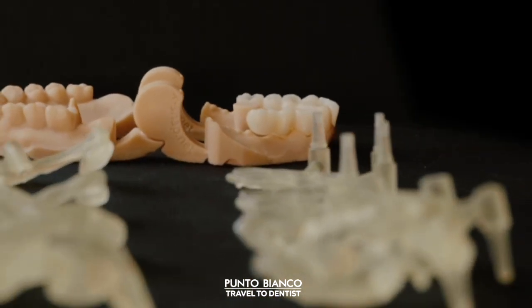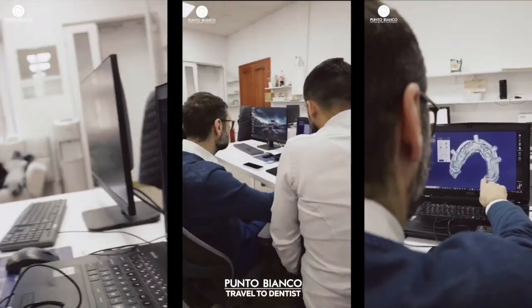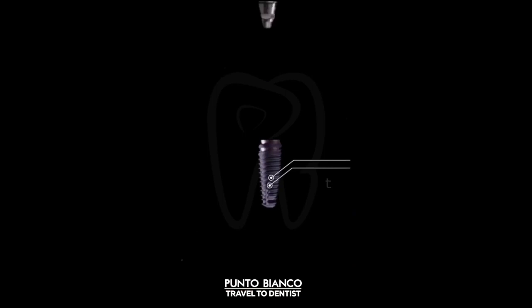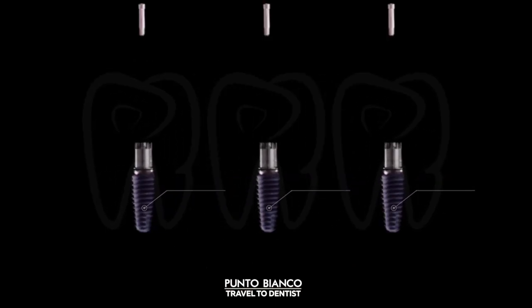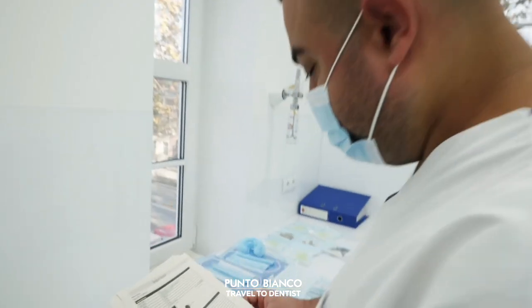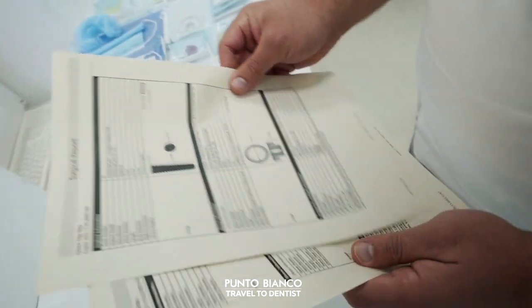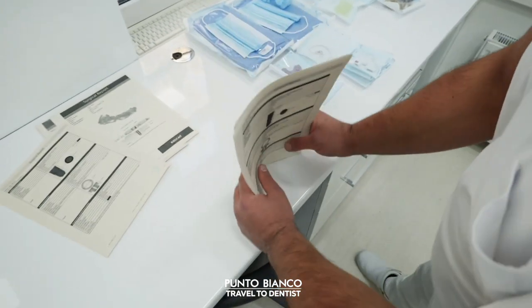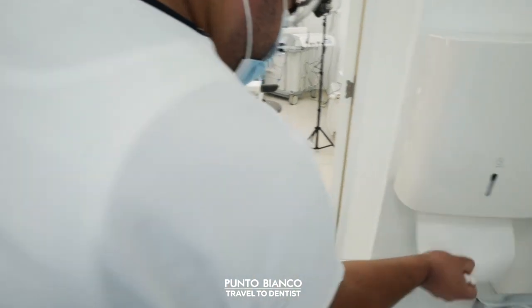You see, all of these components have been previously manufactured in order to have the capability to perform this procedure and more. We planned every implant down to the millimeter in accordance with the plan. It was carefully planned, and a report was generated to ensure that we accurately insert the implants in the correct location.